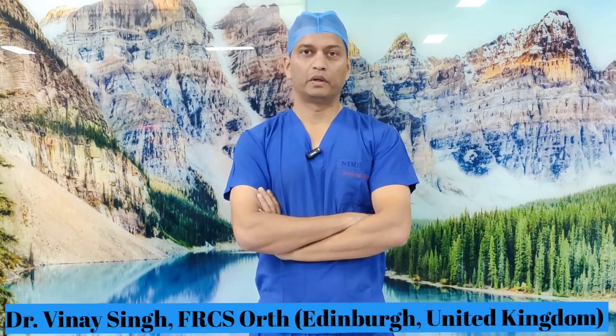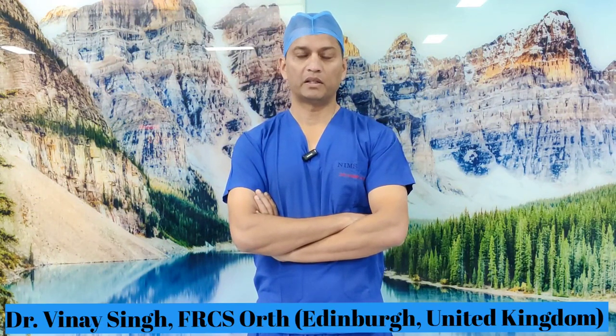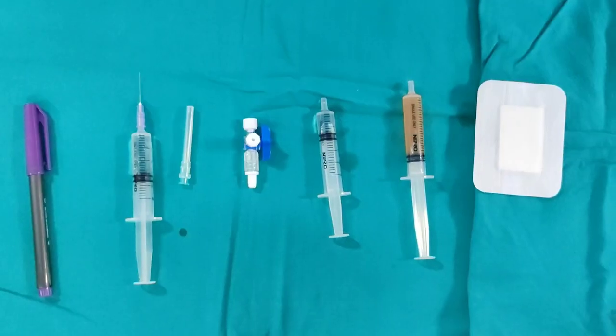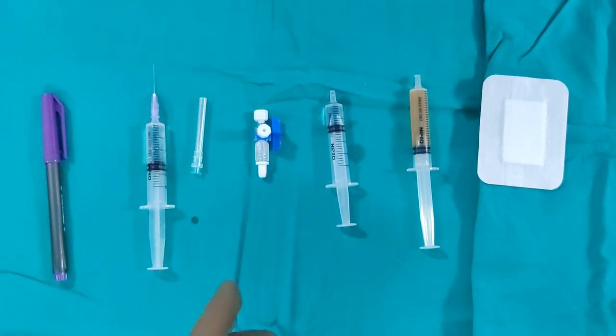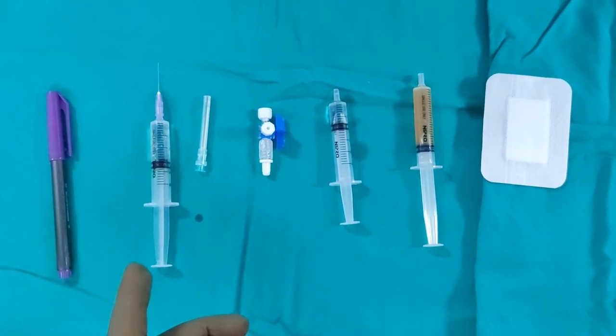Hello viewers, today I am going to show you a small procedure in which I am going to inject platelet-rich plasma — that is PRP — in a gentleman's wrist. You can use the same approach for aspiration in case it is indicated. It's a relatively straightforward procedure and I will show you how to do this safely. You can do this procedure blind, but I am doing this under fluoroscopy.